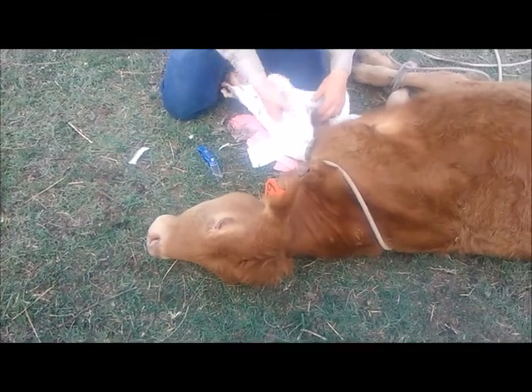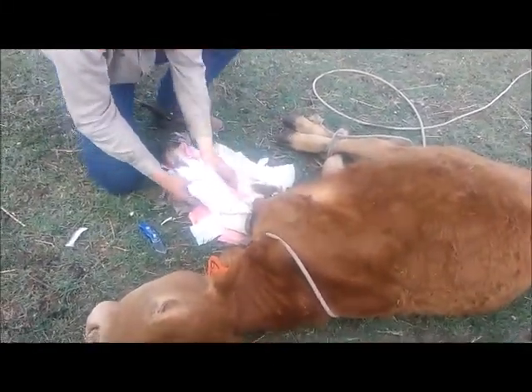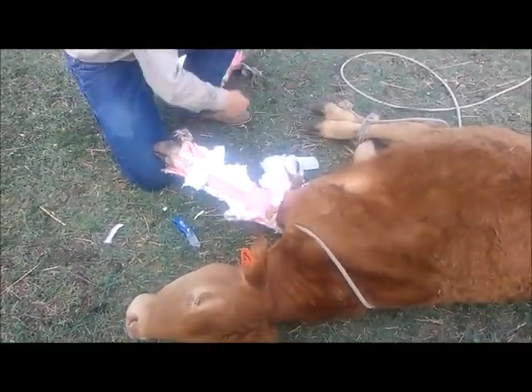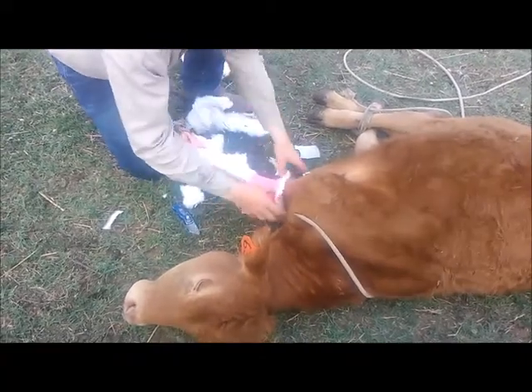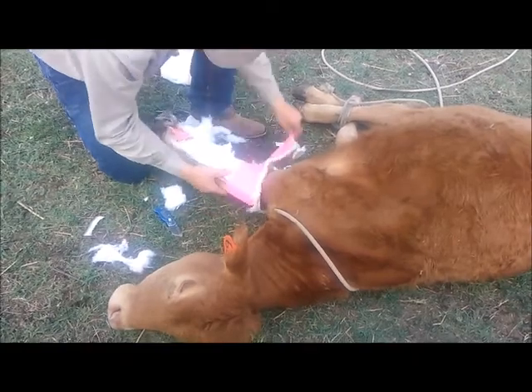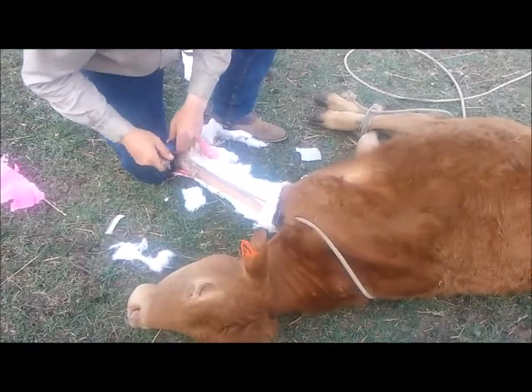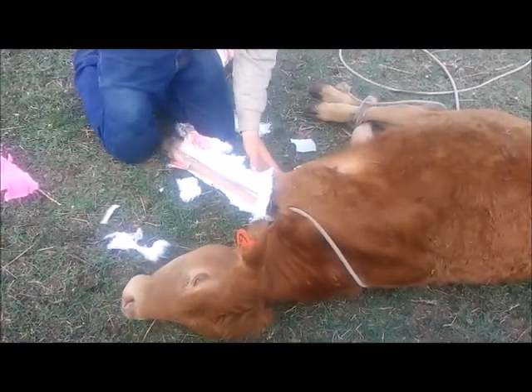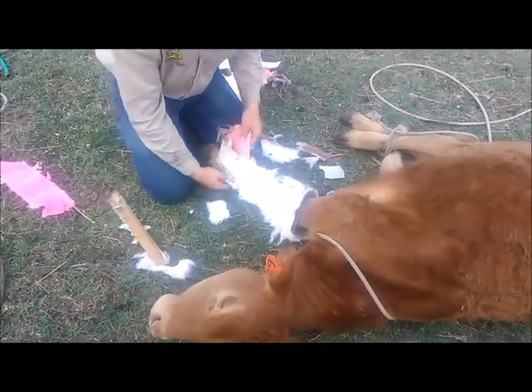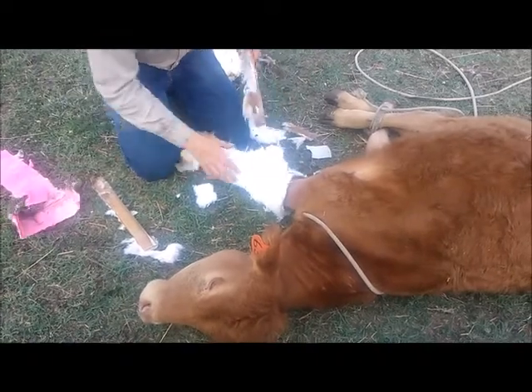You can tell she's huffing a little bit — she's upset. Now, it might be that there's no hair on the leg, but that's not going to hurt her. That's just where all this padding was. And that's vet wrap that held the stick in place to keep her from bending the leg. And cotton kept it from rubbing and sticking to her skin, correct? There's the other stick on the other side.